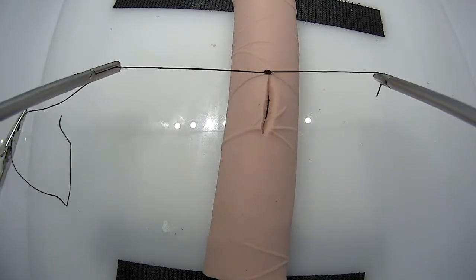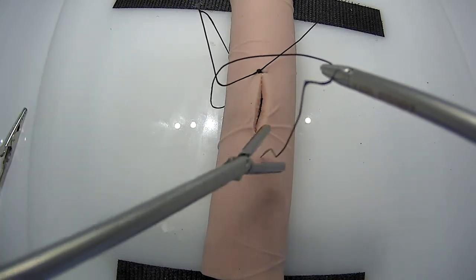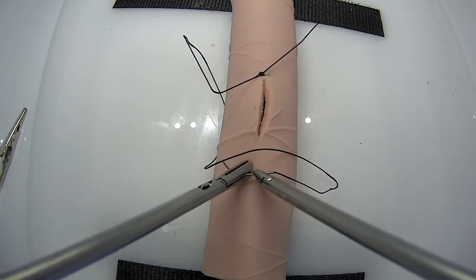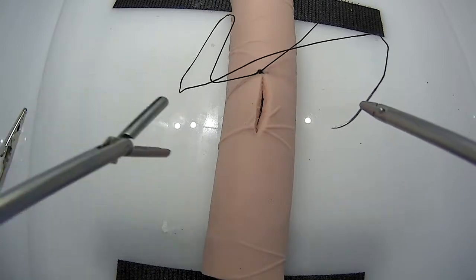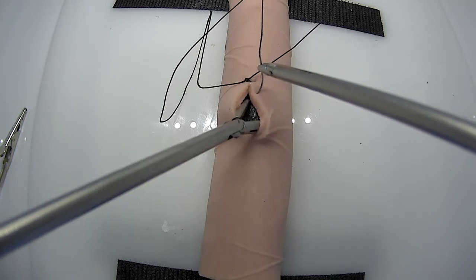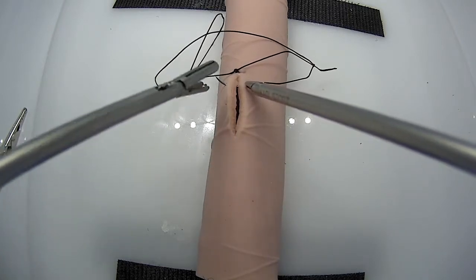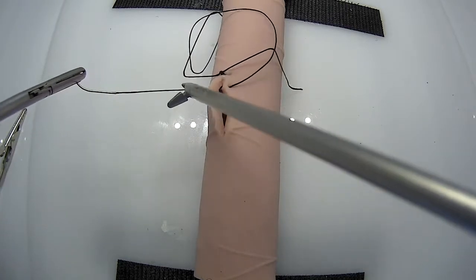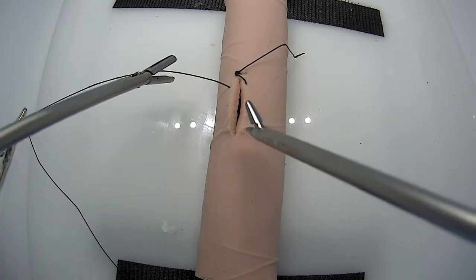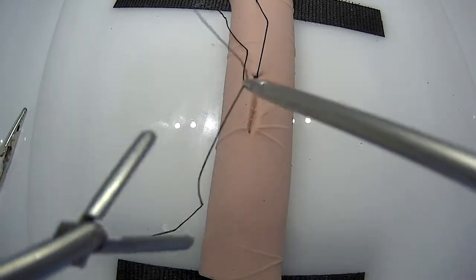We're going to leave the tail there so that we can tie to it at the end. Now we're ready to start our running inner full thickness layer. Once we've taken the second bite, we're going to cinch. This helps keep the suture line from loosening as you go.